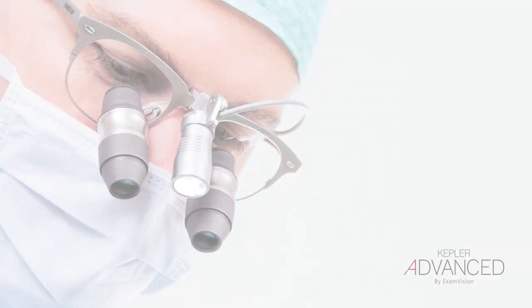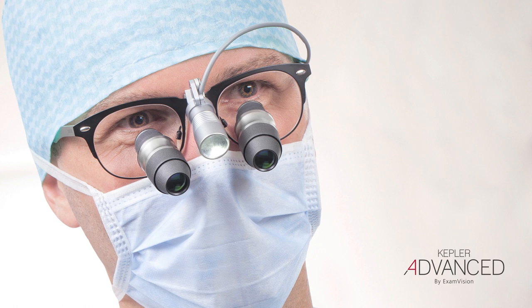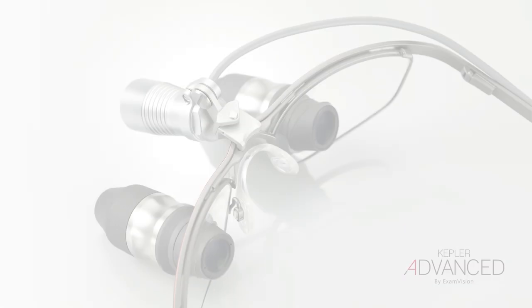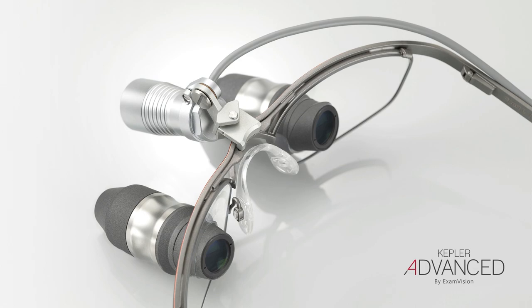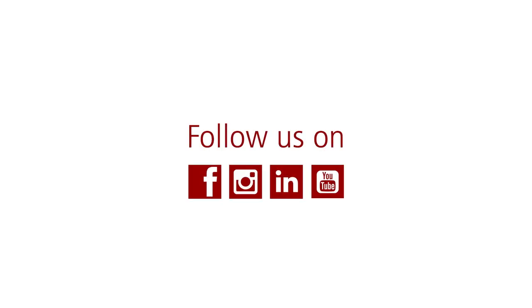Your loops should now be perfectly focused and ready for use. Your optical experience should be excellent. If you experience any problems with alignment or shadowing, check our video entitled 'Does your loop fit correctly?'